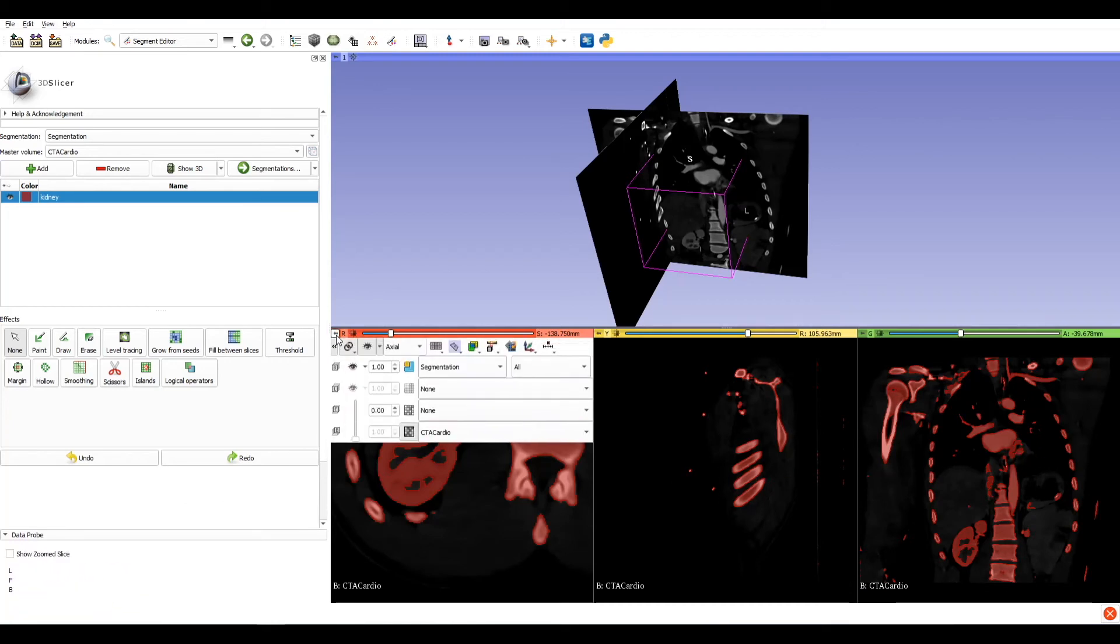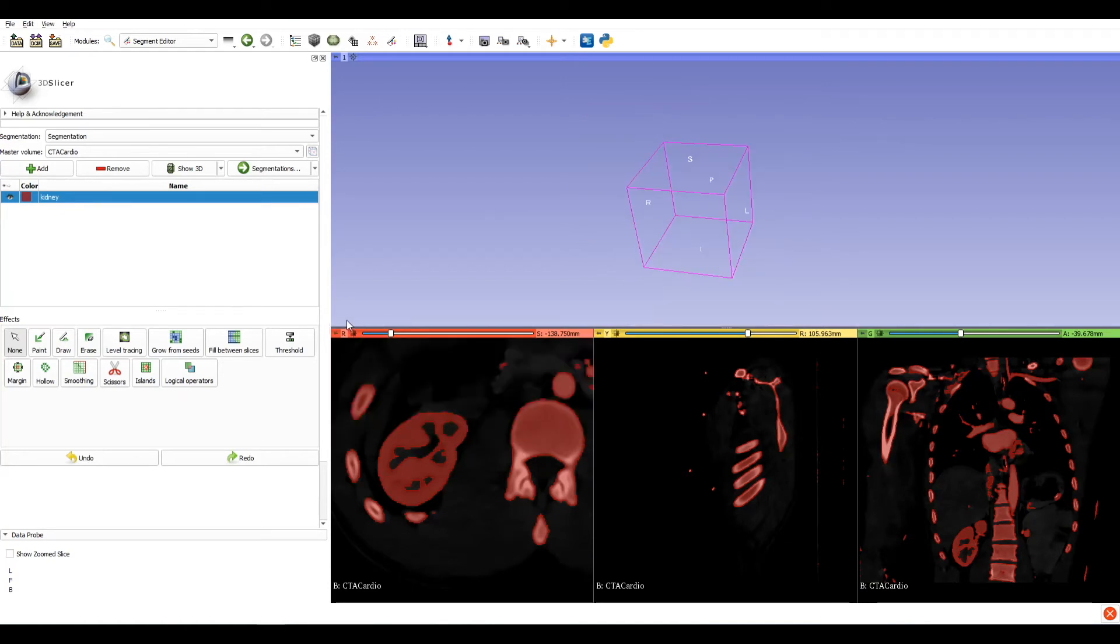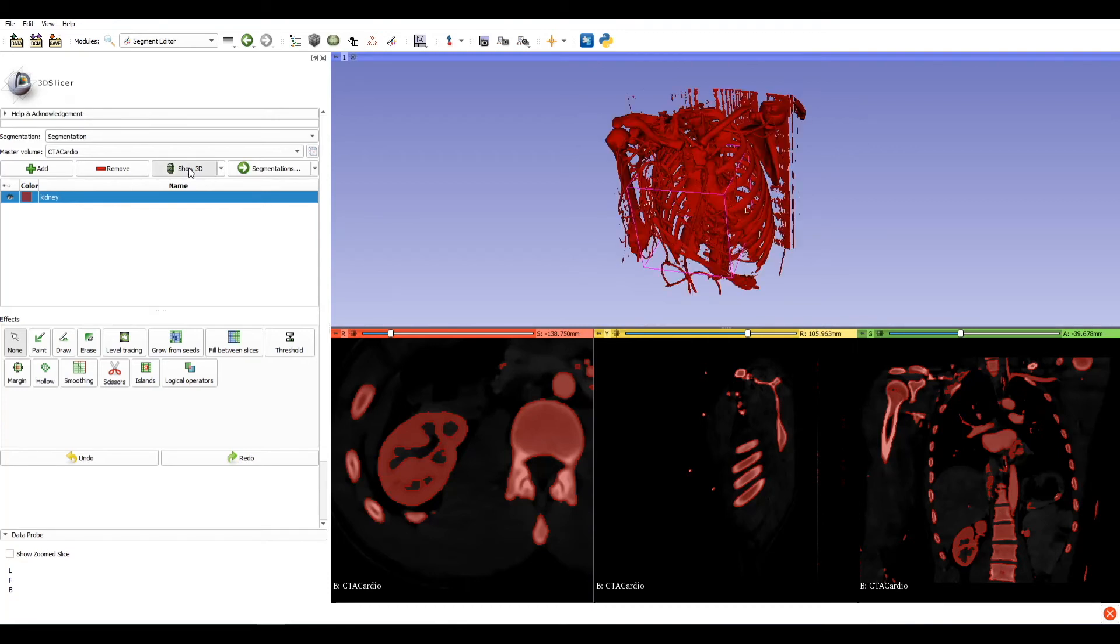Let's hide the orthogonal view in the 3D space and click on show 3D. When you click on show 3D, in the 3D space will appear our segmentation.